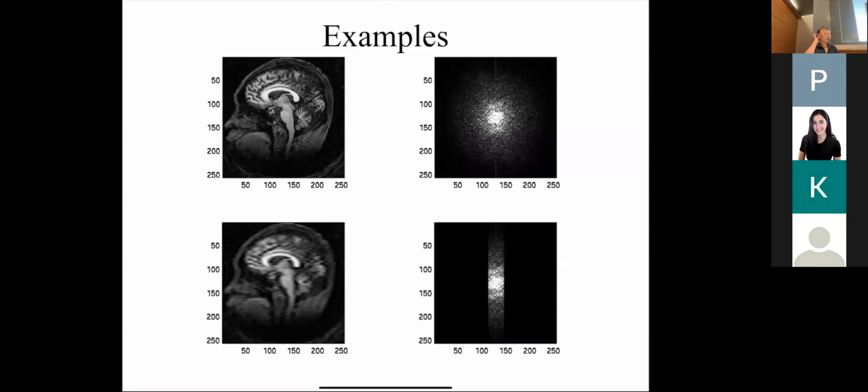Yes. But k-space data is two-dimensional. Yes. It's a function of kx and ky. For the Fourier transform, it can be n-dimensional if you're talking about an n-dimensional Fourier transform. But for this class, we're going to stick with 2D.